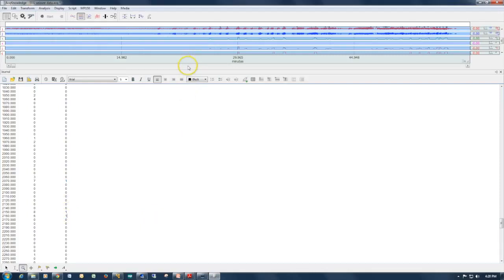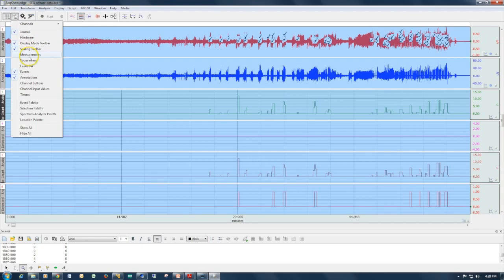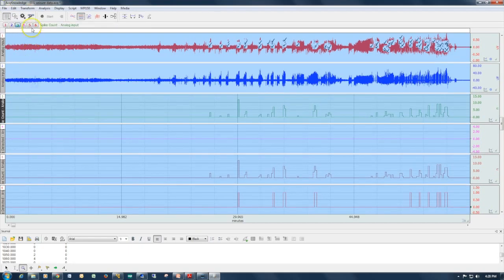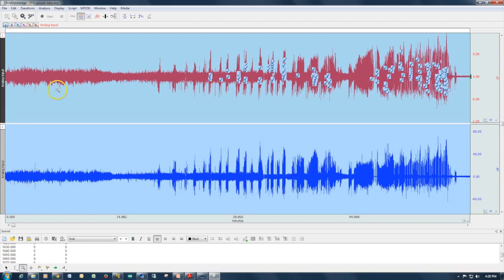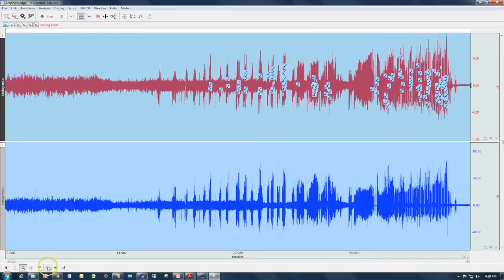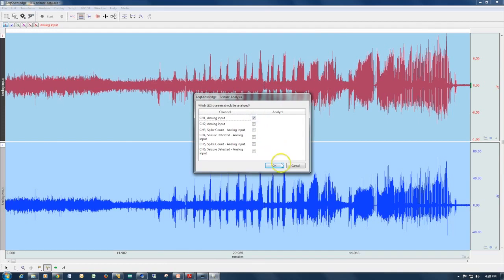The next part I'm going to demonstrate will show, I'm going to delete some of these channels. Actually, I'll just turn them off. And then close our journal out. Our events. So now we're back to where we started. We've got our raw EEG, we've got our difference channel down below. Go into the analysis menu, select EEG and seizure analysis, analyze channel 1.